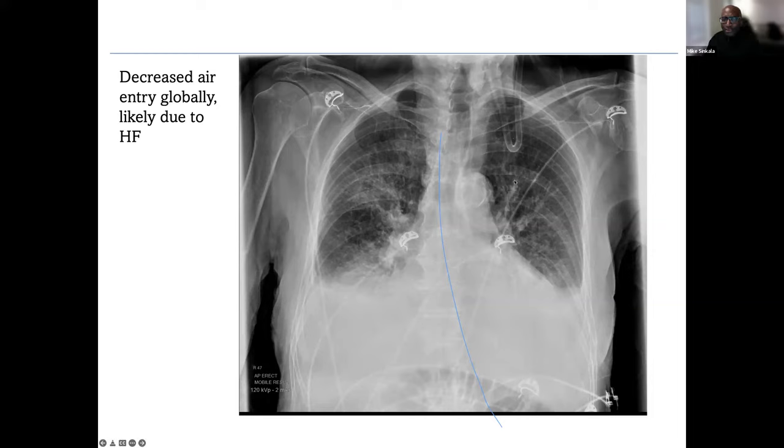So we do have dilatation of the upper venous supply. There is enlargement of the upper vessels here, meaning that there is what they call upper lobe venous diversion or cephalization in this case, with very hazy airspace opacities. There is water now perfusing through the vasculature here. So we do have pulmonary edema, cephalization, heart enlargement, and pleural effusions, a classic example of heart failure. So this patient has heart failure because they have all those things I was talking about.